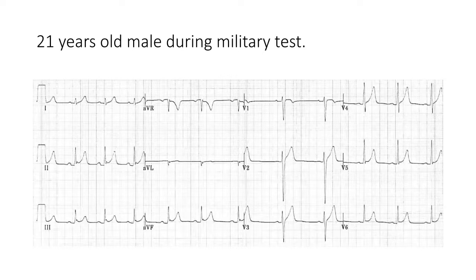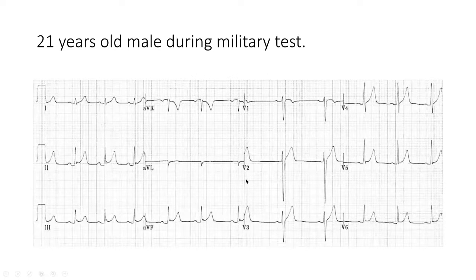This is an ECG from a 21-year-old male during his military test. Starting from lead 1, 2, 3, the only obvious finding is some sort of notching and ST elevation in the inferior leads, and similarly in the precordial leads. The young male was completely asymptomatic and this was an incidental finding.